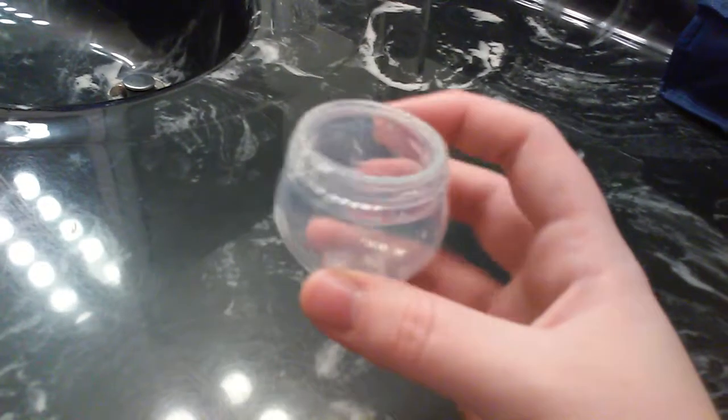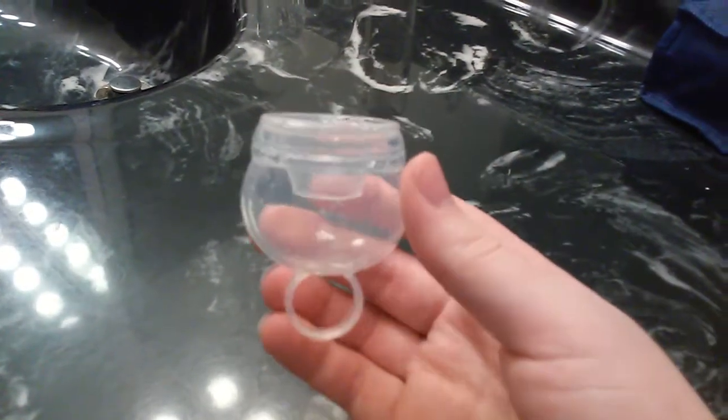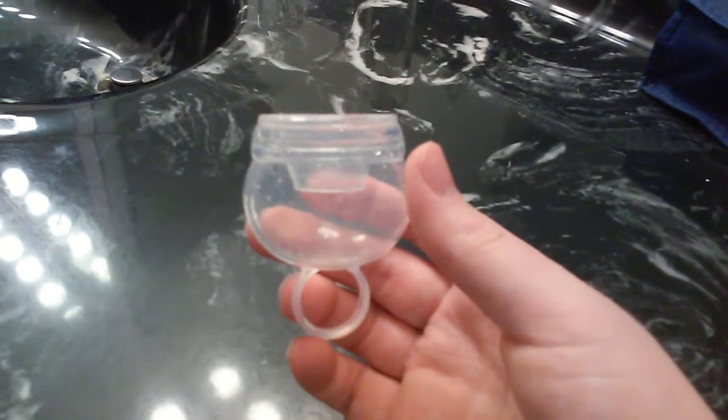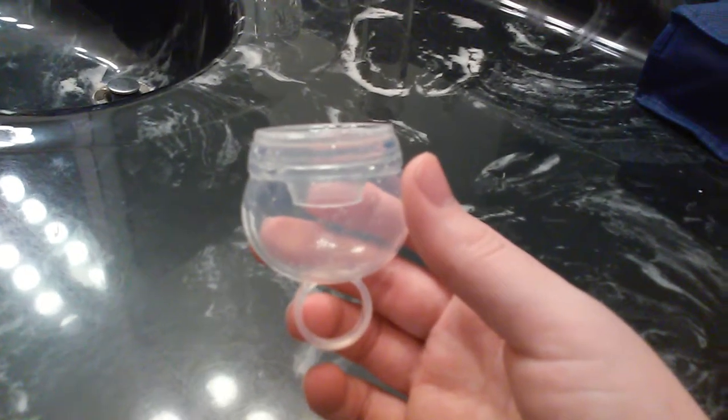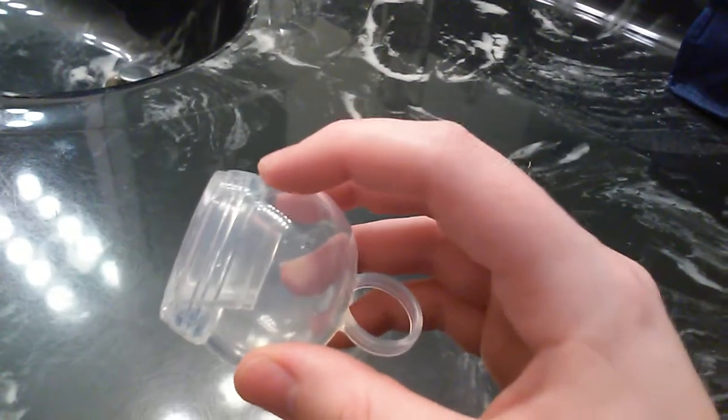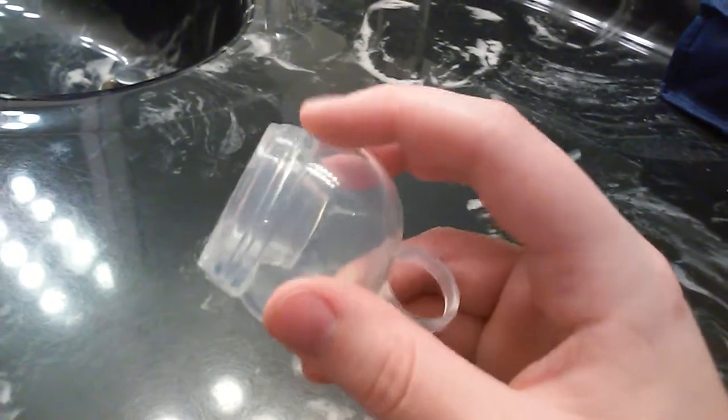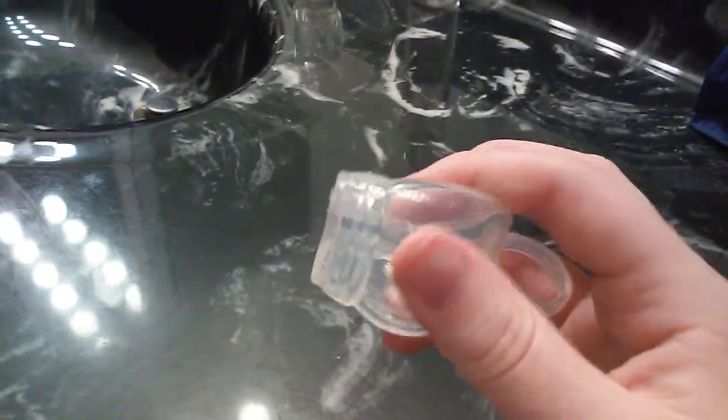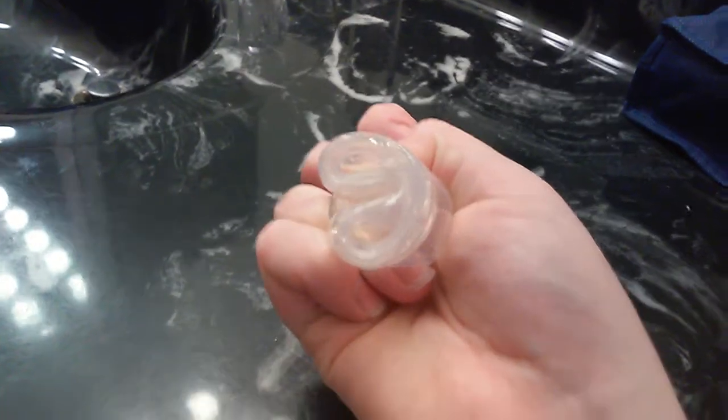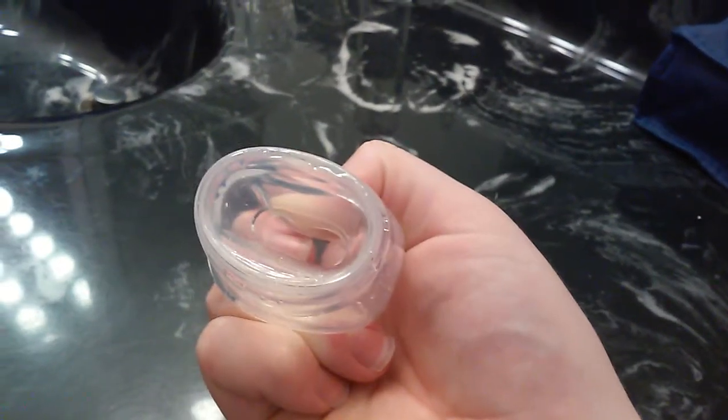This cup also has a bulbous design which is different than most menstrual cups. This cup also has a unique feature to help you fold. While you may not be able to see this on camera, there are little bumps right around here on the rim. According to the instructions that's the proper place to fold the cup down. So you fold it from that rim, insert it, and release.